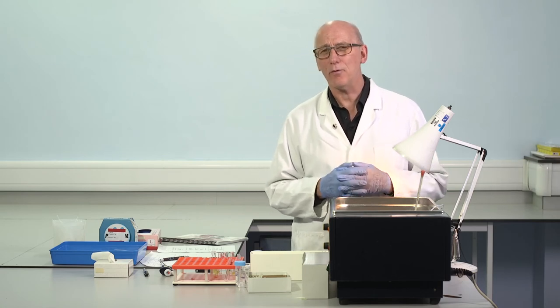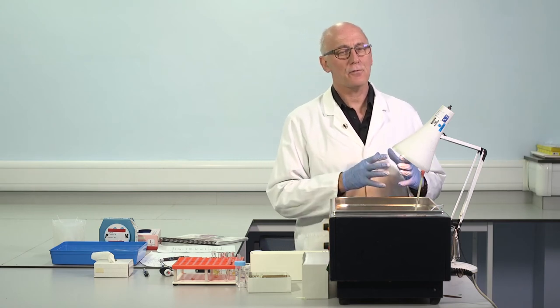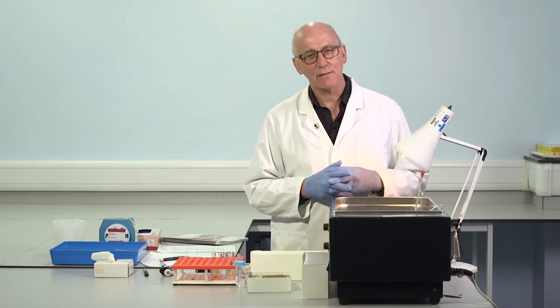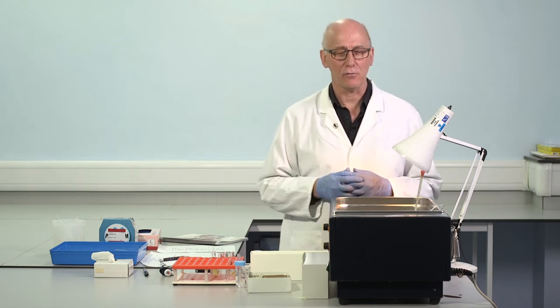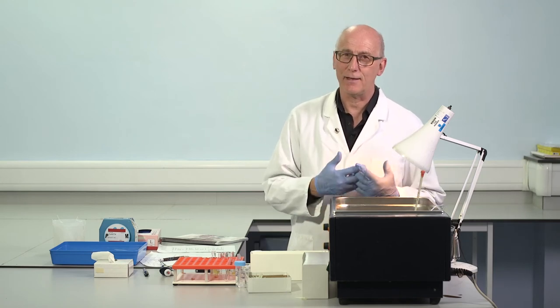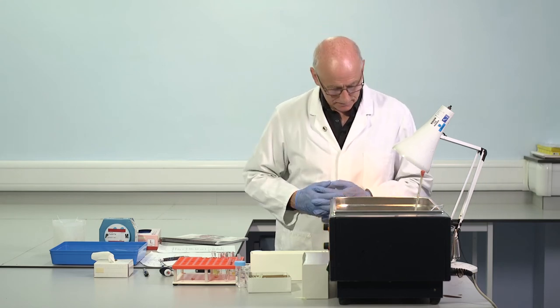So I think it's really important that we don't miss low titer antibodies, and that, in my opinion, is the risk. If we do an incubated mix, we may obtain a false negative in which we fail to detect a low titer antibody, and I think that's a big issue. So my preference is to go for the more specific test and not to make the incubated mixtures for that reason. I accept that some centres have done this successfully.